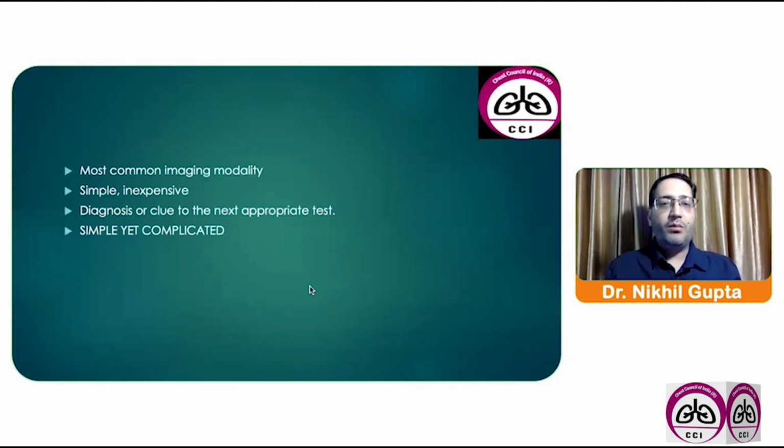Chest radiography is the most common imaging modality. It is simple, inexpensive, and it gives a clue to the next appropriate test or the diagnosis itself. It is simple to interpret, yet complicated in so many ways.